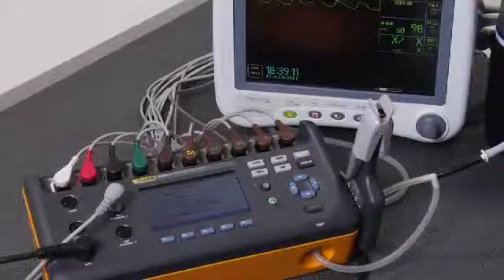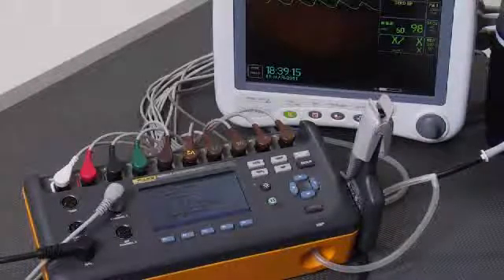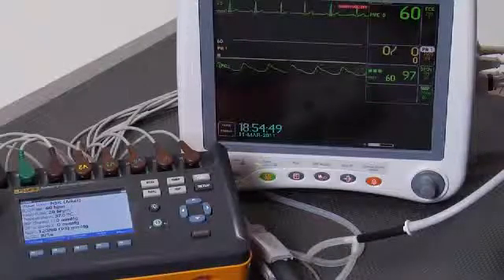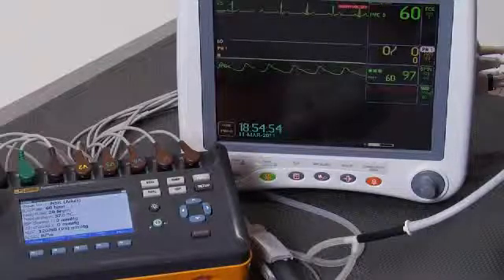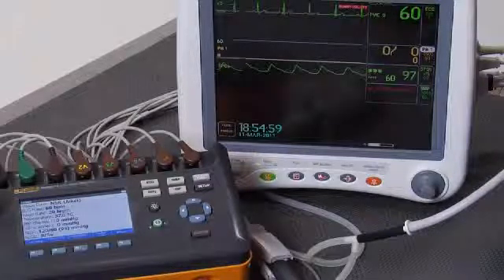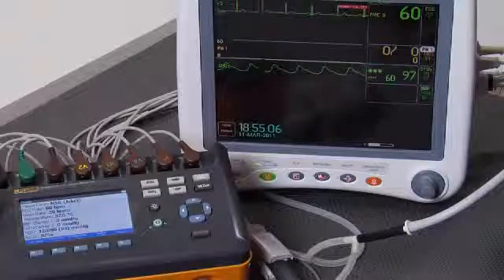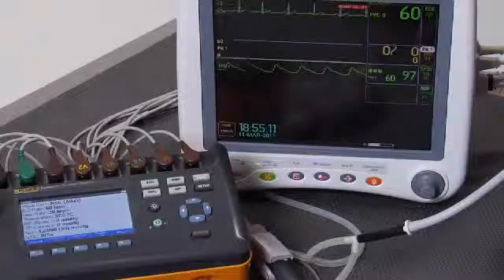Patient monitor testing can be quicker and easier than ever before with ProSIM 8 from Fluke Biomedical. We're going to do a complete but quick test of this patient monitor. The parameters we're going to test are ECG rate, respiratory rate, invasive blood pressure channel 1, cuff blood pressure, IBP measurement, and oximetry. We're going to try and get all of this testing done in under 5 minutes.